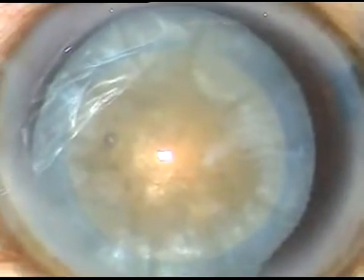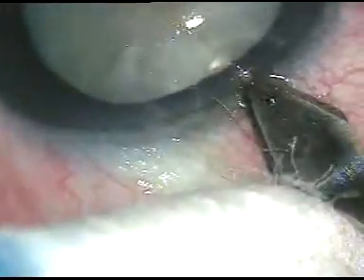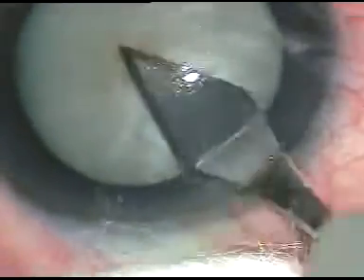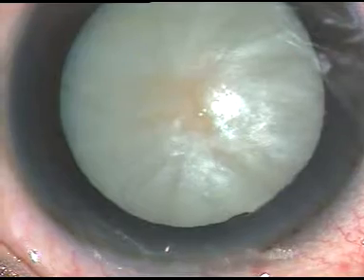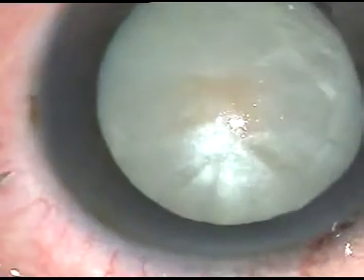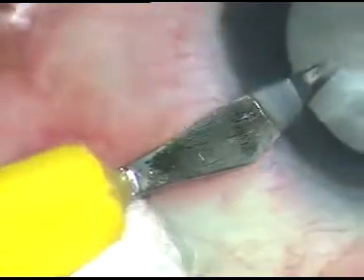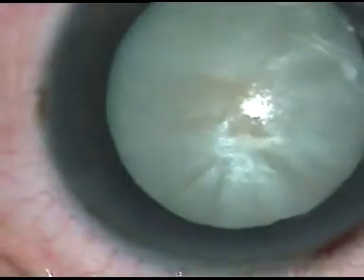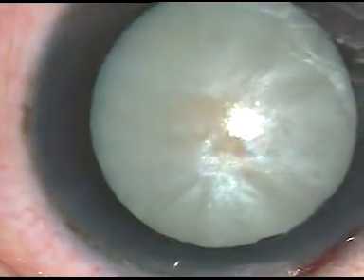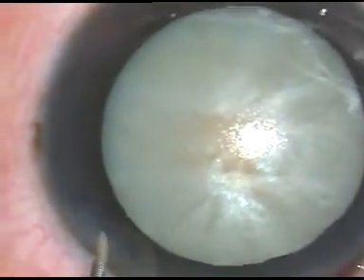Second case. This is the main incision with 2.8 mm keratome. We can see the anterior capsule is taut and convex and protruding towards the corneal endothelium. It means there is a lot of raised intralenticular pressure.